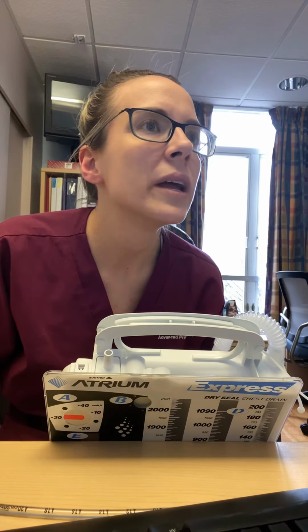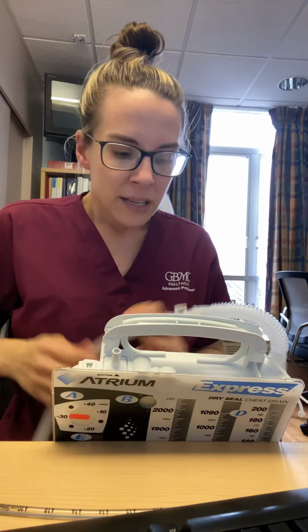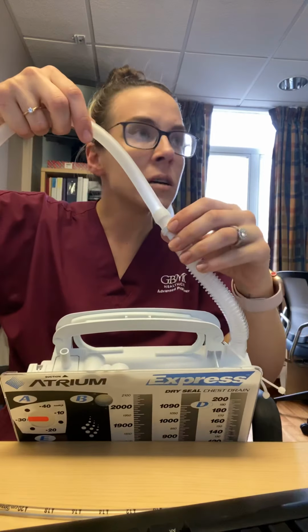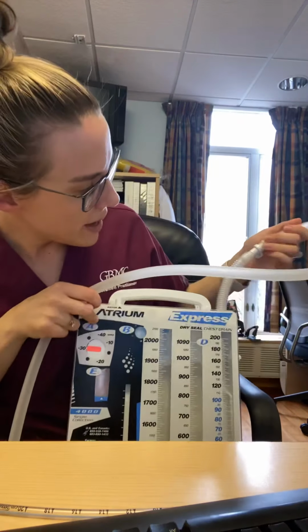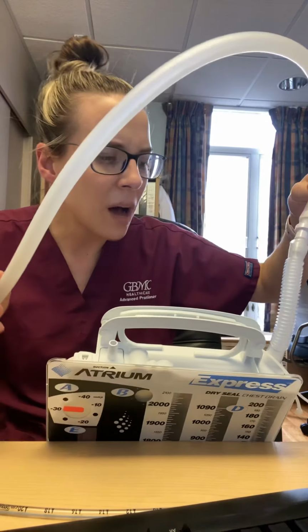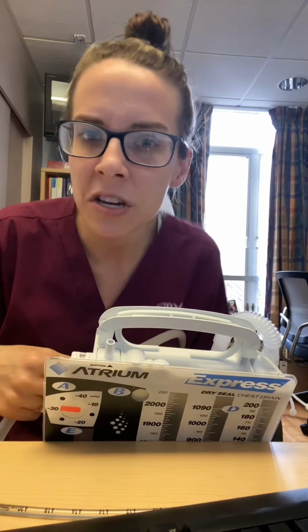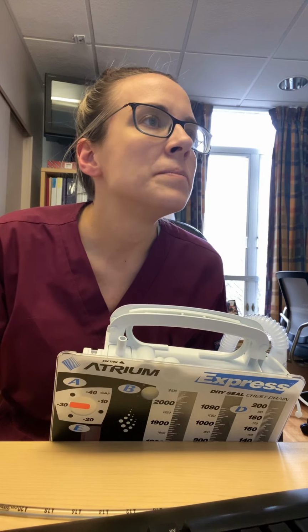Next slide, where were we? Oh, we're still on slide 7. All right, so needleless access port. Do we have that on this one? I don't think we have that on this one. And I don't think we're commonly sending samples from chest tubes, and you're not going to be asked to do that, so I wouldn't worry about it.